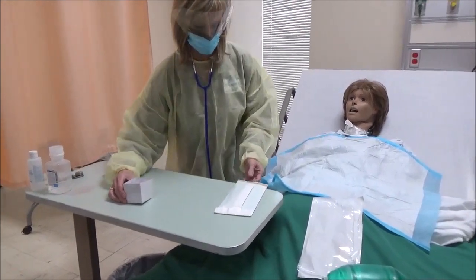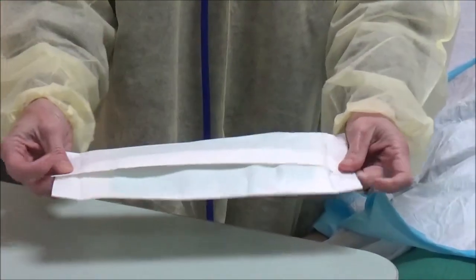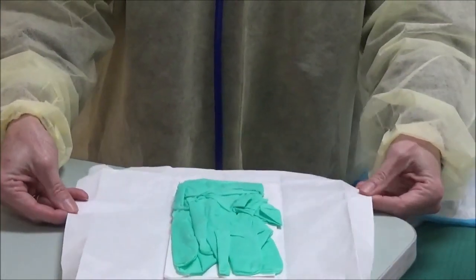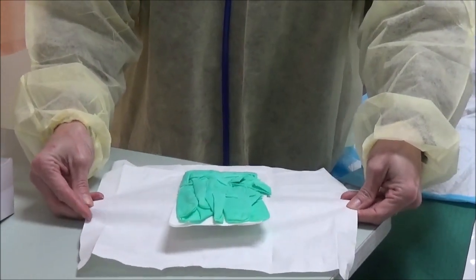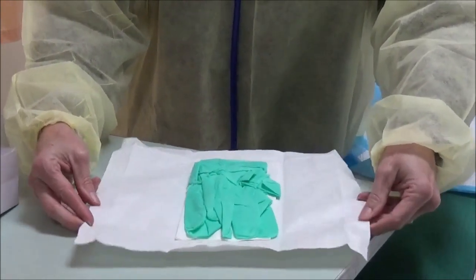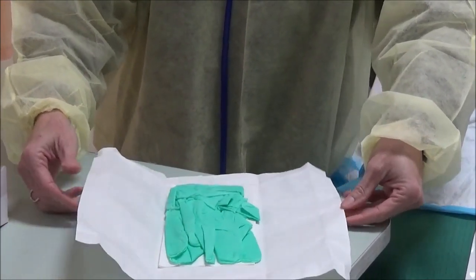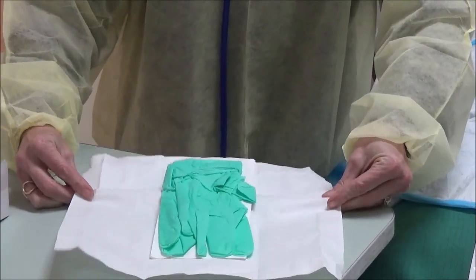Now I am going to open up my package, and in this package are my sterile gloves and the suction catheter. So this has my sterile gloves right here on the top. Now, this is now all sterile inside of here, and there are some principles that you learned about a sterile field. That everything is sterile until you open it up, and then once it's opened up, that 1-inch border we consider to be contaminated. I'm going to make sure that that kind of stays open. Sometimes I have to manipulate.